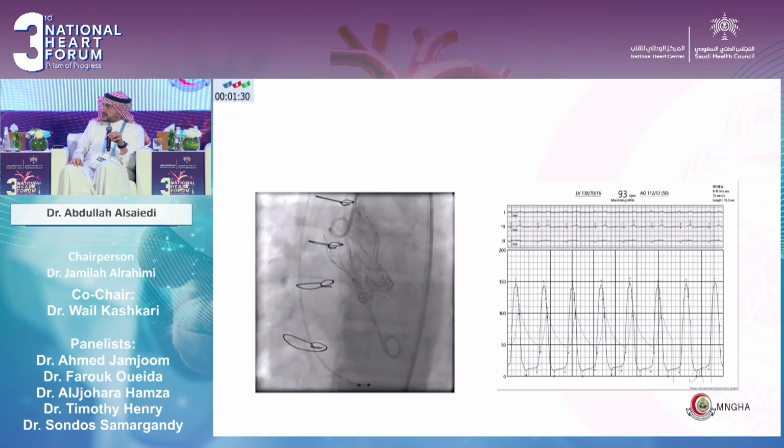The other thing is just make sure it's teamwork. A surgeon has to be aware of what's going on, and God forbid an urgent procedure is needed, then where is he going to cannulate? Is it the neck? Is it the groin? So this has to be discussed before and planned.